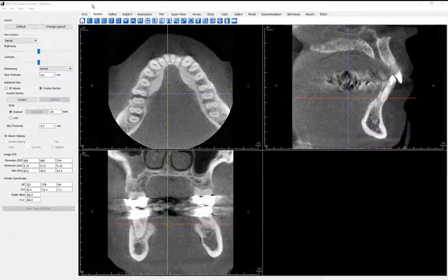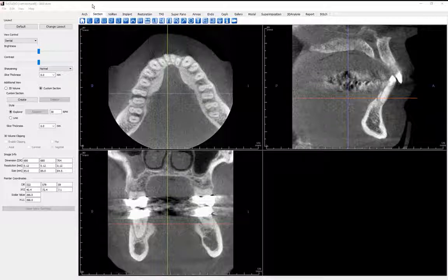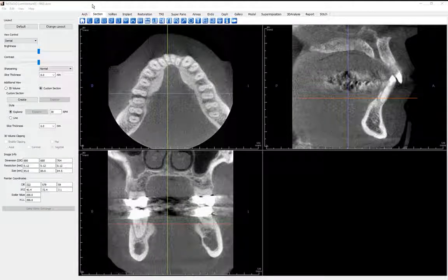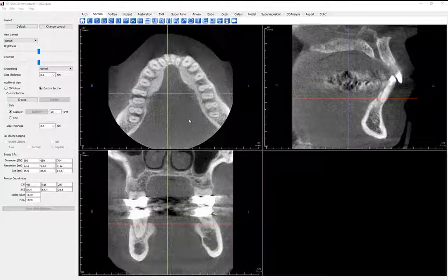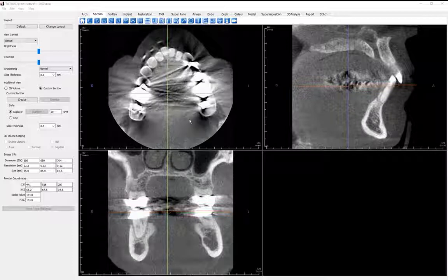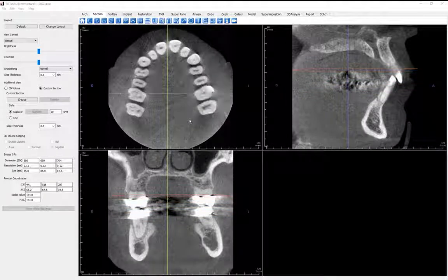Let's begin in the Section View tab. While this scan is far from pristine because of the appearance of surface artifacts caused by the patient's restorative work, it will demonstrate the software's ability to see through and past imperfections that may be present in a scan. Using the mouse wheel in the Axial Rendering window, let's scroll through the slices until we see an indication of a possible fracture.